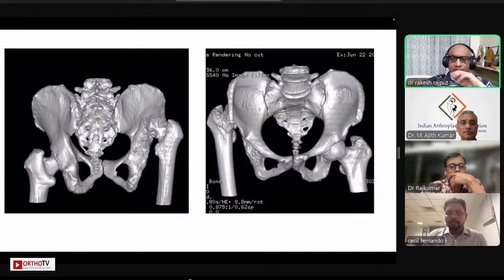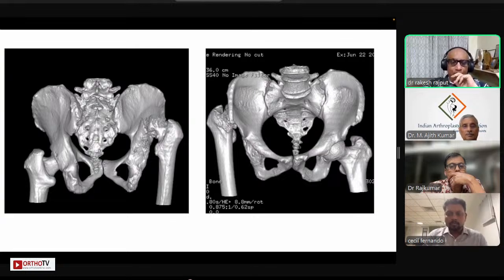Right. So I think the principles are pretty clear, that you go in the line of like a DDH. So there is no true acetabulum on top. So you got to bring it back in the original acetabulum. And when we do this, these are one of the few cases where we have to be prepared even in a non-DDH case to be actually doing a subtrochanteric osteotomy.